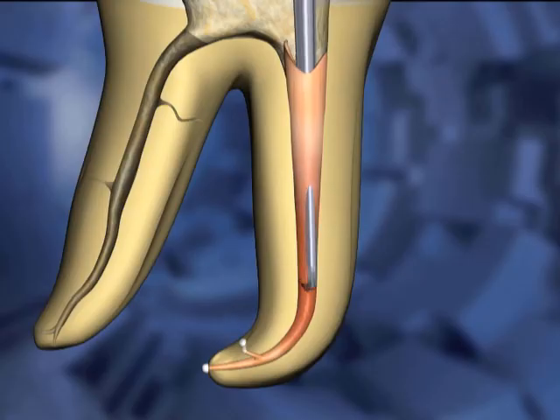This motion separates the gutta-percha mass into a segment apical to the heat carrier tip and a segment coronal to the tip. The carrier is then removed from the canal space.